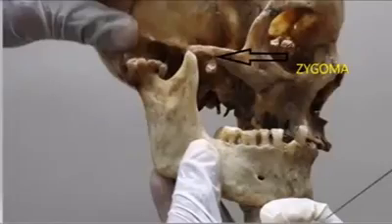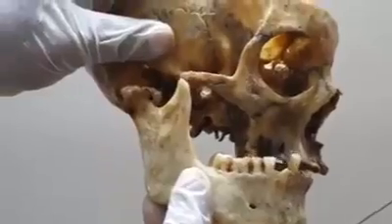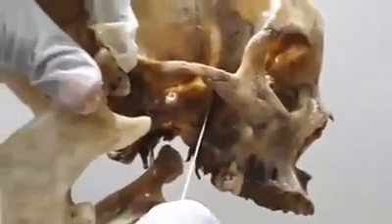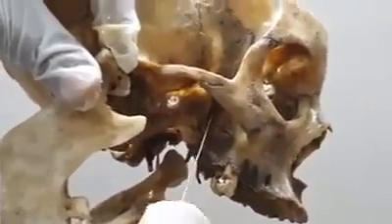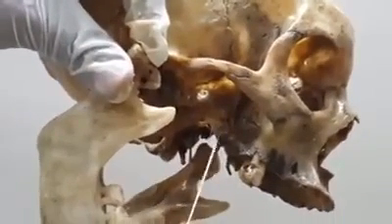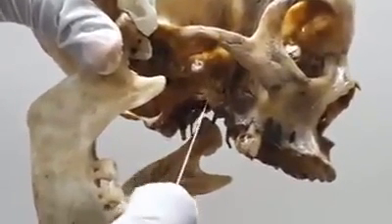In this video, we'll be showing the normal anatomy of the pterygopalatine fossa where the sphenopalatine ganglion lies. Here you see the lateral view of the skull and the zygomatic arch has been shown there. Now I am removing the mandible. Now my needle is inside the pterygopalatine fossa where the sphenopalatine ganglion lies. Anterior to that is the maxilla and posterior to that is the lateral pterygoid plate of the sphenoid.